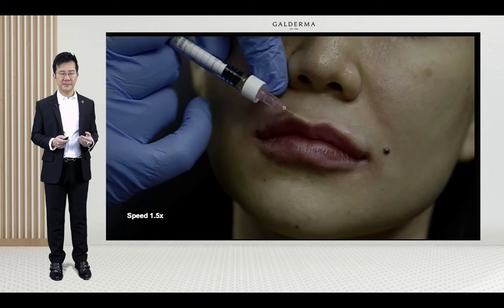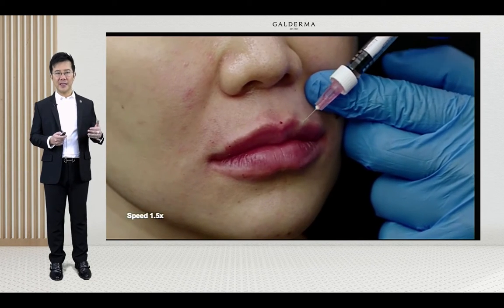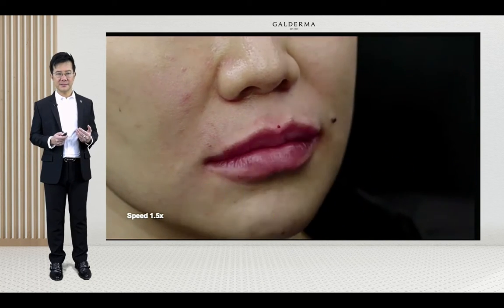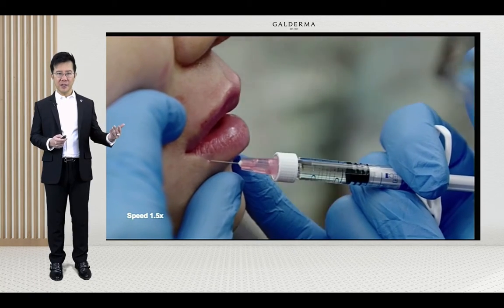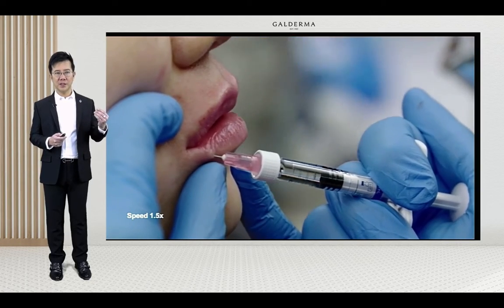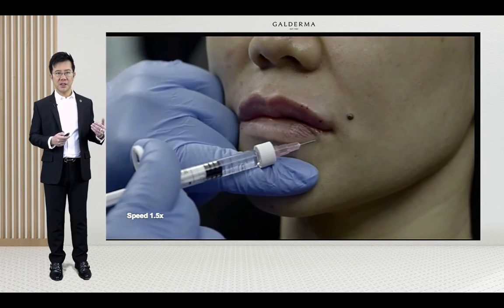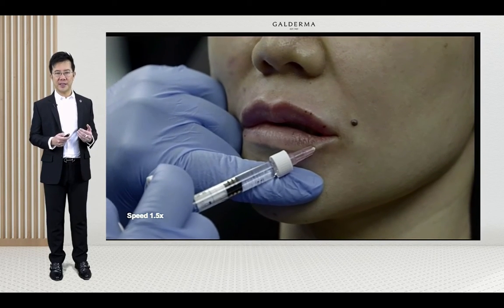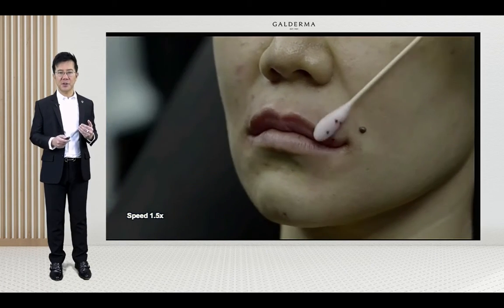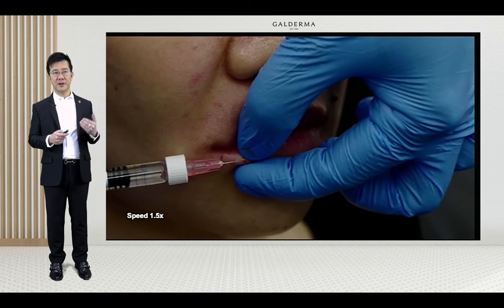And on the other side. And sometimes I inject the dry vermilion like this. On the lower lip, I support the corner of the mouth, just 1 small drop. I don't want to create a bulge here, because here it should be slightly depressed. As you can see, a little small drop. And then move to the vermilion border.